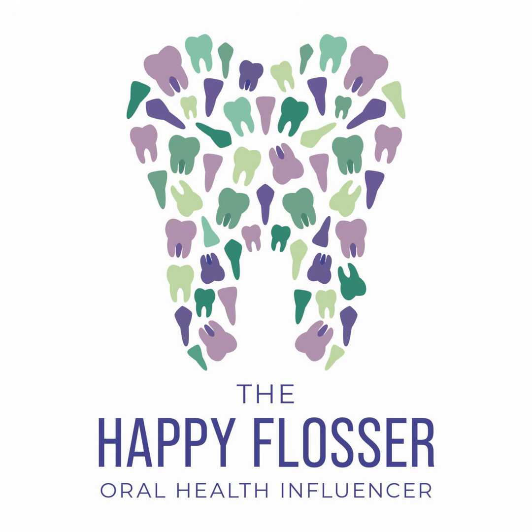You may notice a nodular radiopaque mass below the posterior angle of the mandible. You may notice something that stands out a little different. So if someone is predisposed to have a higher risk of a stroke, something may show up on that Panorex x-ray, but you have to be looking for it. So it's important for you to stay focused on some of those things that can show up.